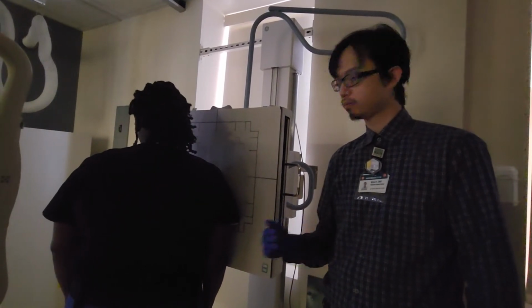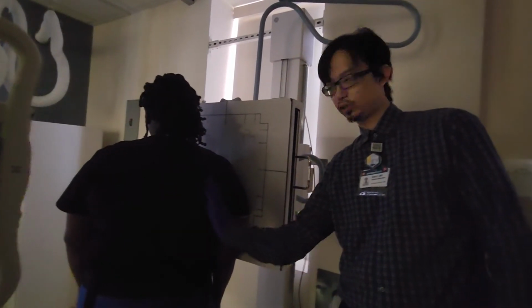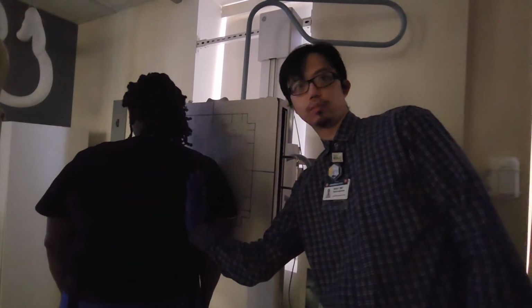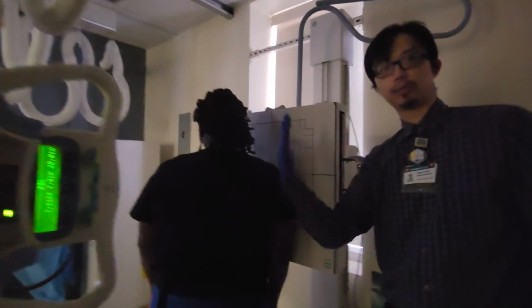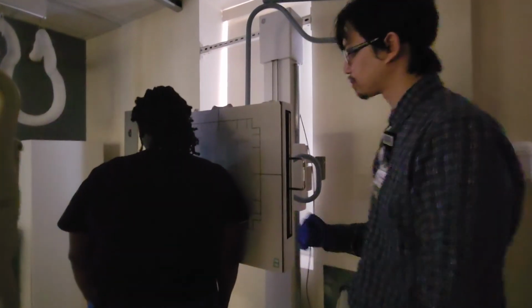So the long part of the Y is the body here. You superimpose the medial border and the lateral border of the scapula to form the long part of your Y.